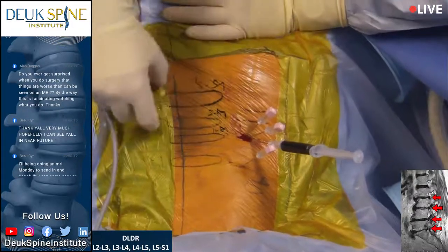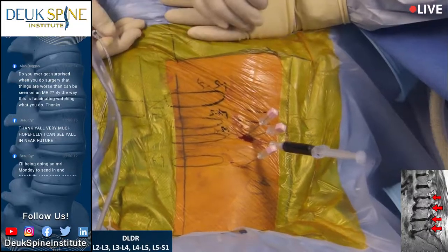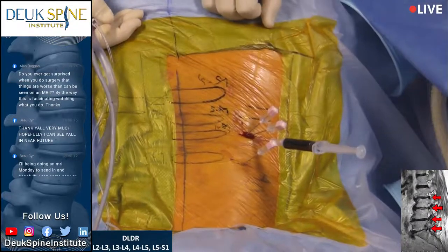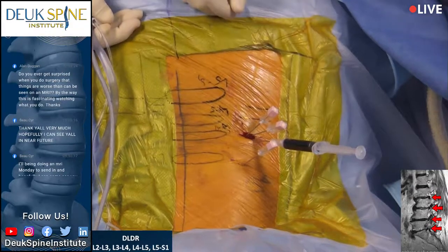Now, if he had just pointed down here, I would just be fixing L4-5, L5-S1. But because his back pain starts here and goes all the way to here, we know that he's probably got pain from L2-3 as well and L3-4. So I have to treat all of them.